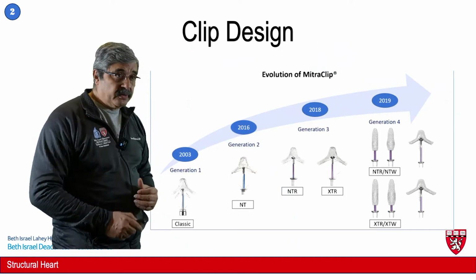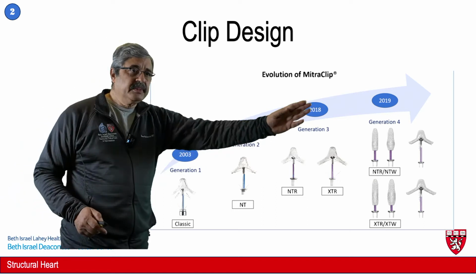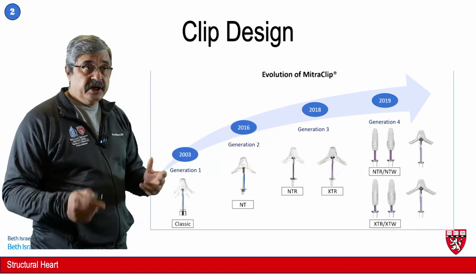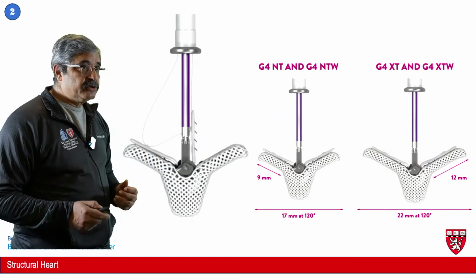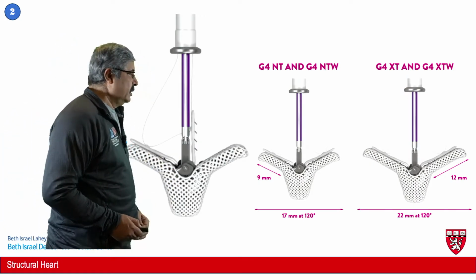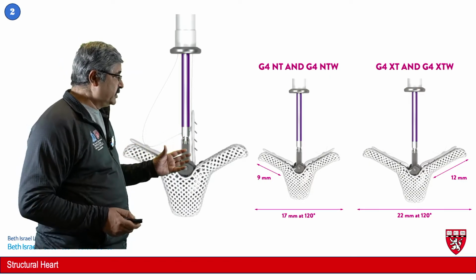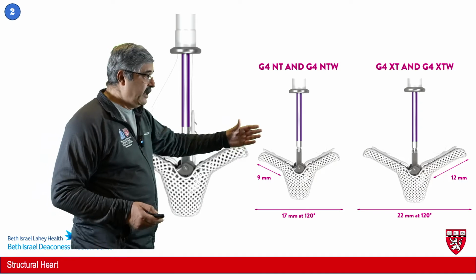Now, the clip has, over the years since its inception, from 2003 onward, gone through multiple iterations, and now we are into generation 4 of the clip. Now, this is truly a technological marvel. We'll go over the different designs and the dimensions of it. So there are two versions, that is the generation 4 NT and XTs.